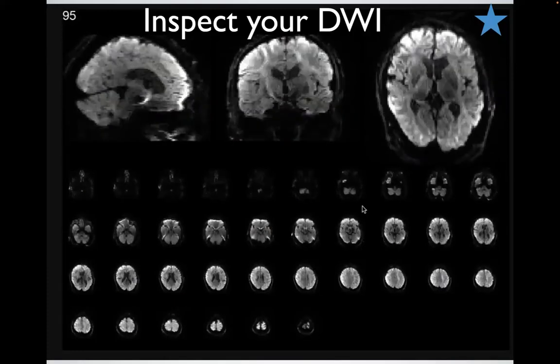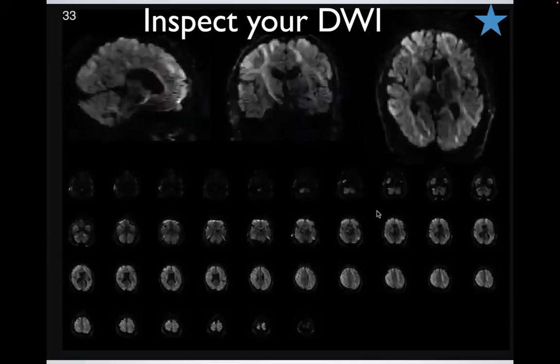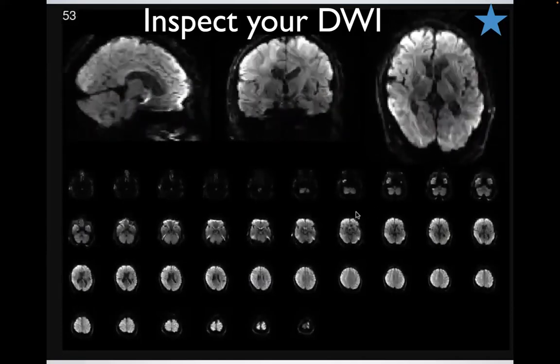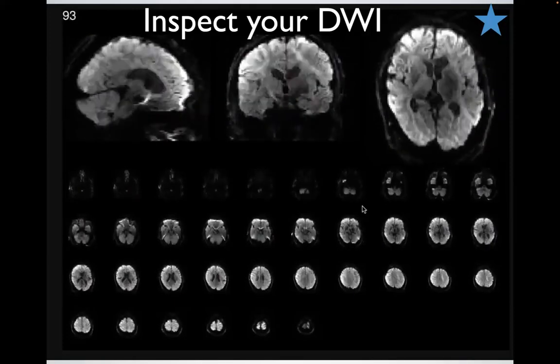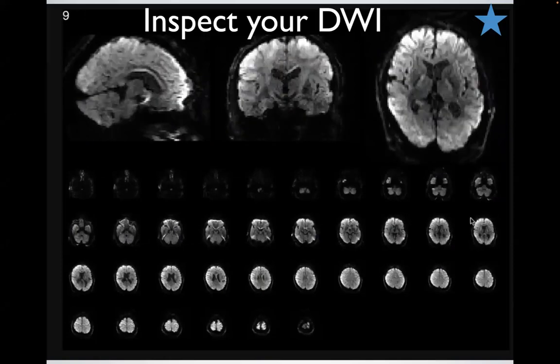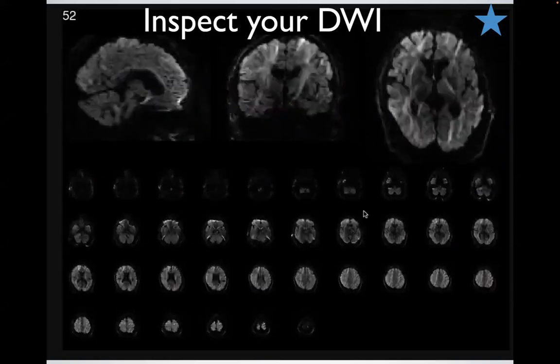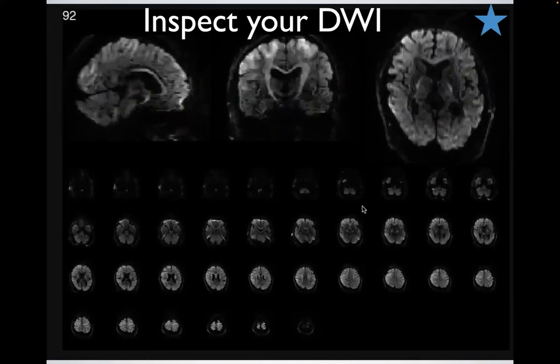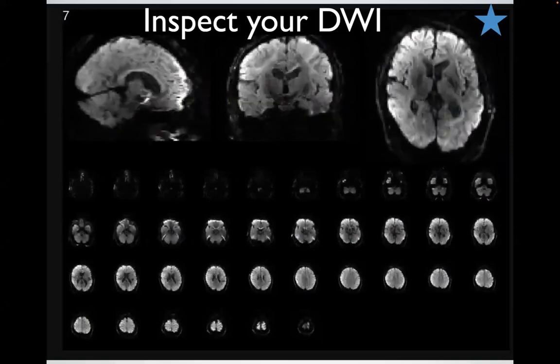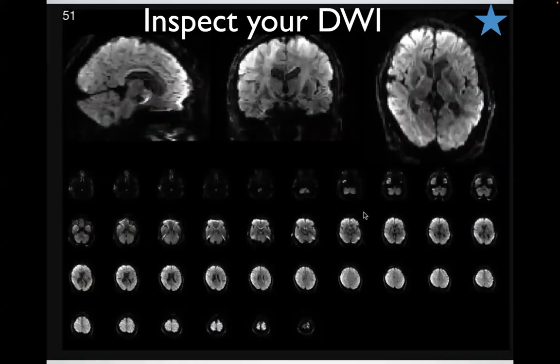Luckily, these were big issues when I was a PhD student. Now, 20 years later, these are kind of solved. So that's cool. We can really get nice, high quality data. But I say inspect, run these videos. Now we have tools that can create HTML files. You can just look at them in the browser. And if you have a missing slice or huge artifacts, just throw the data away.